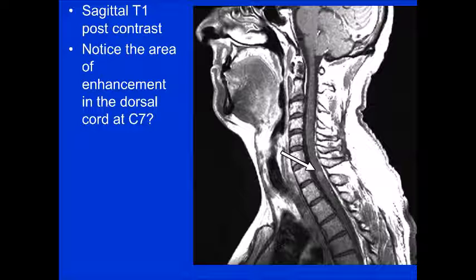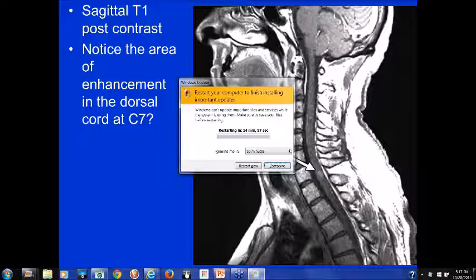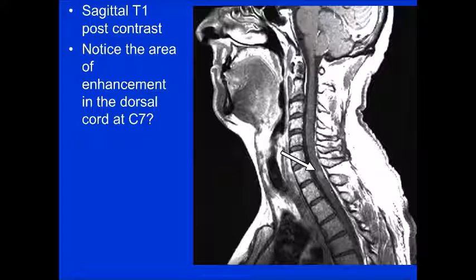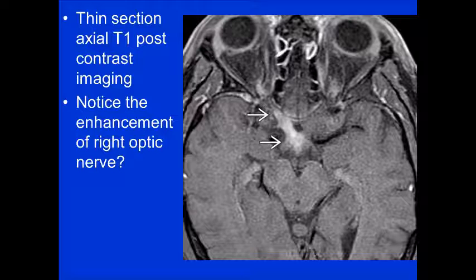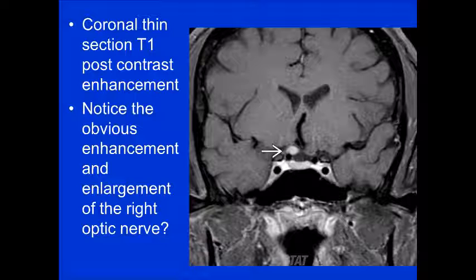When patients have visual symptoms, we may image the optic nerves, though it's not usually required unless symptomatic. Findings include dilation of the optic nerve sheath usually posterior to the globe, and optic nerve sheath enhancement. On the thin-section axial T1 post-contrast image on the right, you'll see enhancement along the optic nerve — a pretty classic but sometimes faint finding. On the coronal image, there is obvious enhancement and enlargement of the right optic nerve, correlating with the patient's symptoms.